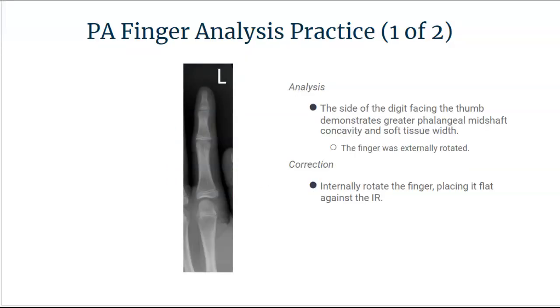In this first practice analysis, you can see that the concavity on one side of the finger is greater than the other side with the soft tissue. This means the finger was externally rotated. We need to internally rotate that finger, placing it flat against the IR, to get equal concavity on both sides of the finger for the soft tissue in order to get a true PA projection.